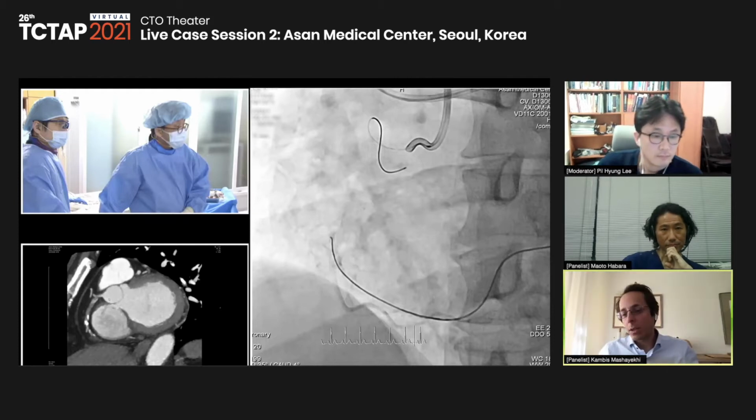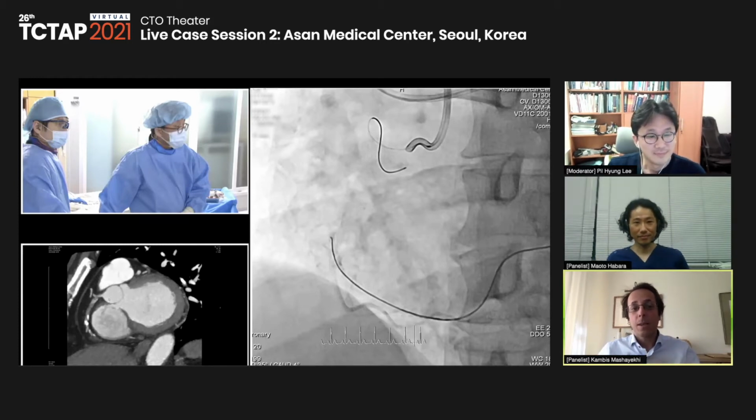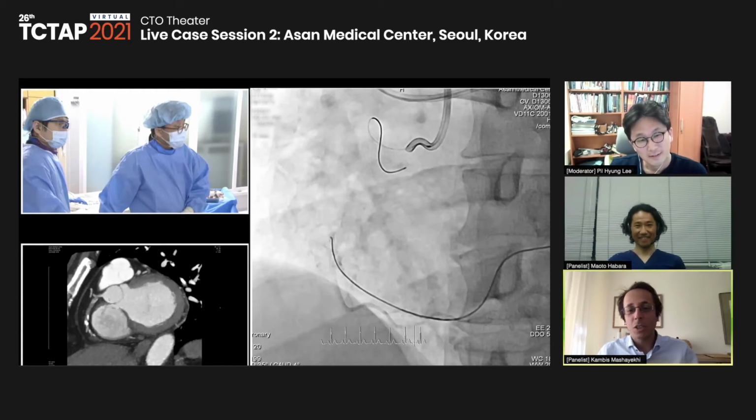Or is it more that you say, okay, I have so much experience, I know approximately if I can pass? Or are you also already using artificial intelligence algorithms? That is always my dream, that my computer says to me, I analyzed the last 2,000 cases of you, Dr. Mashayekhi, and the chance of this collateral is very high. So what are you doing nowadays, and where are we going in future?